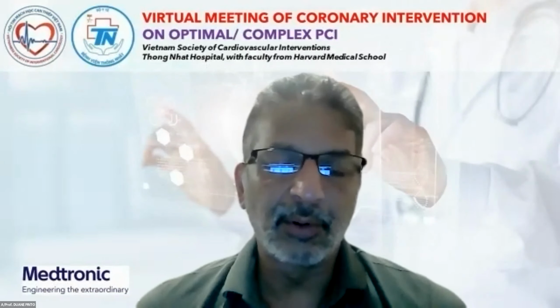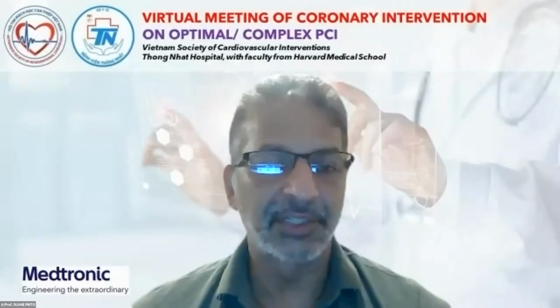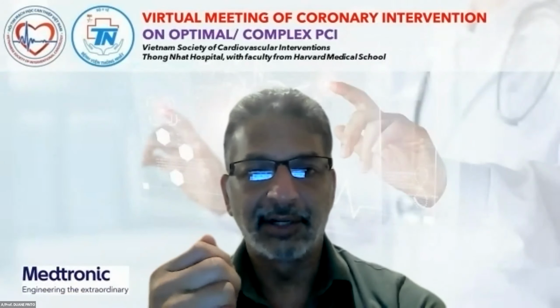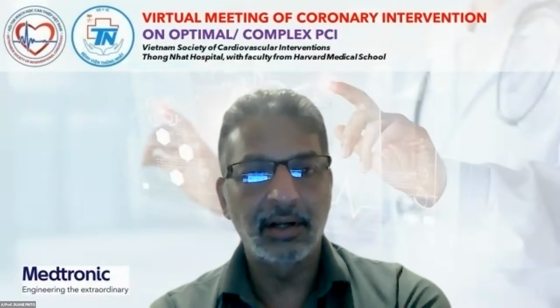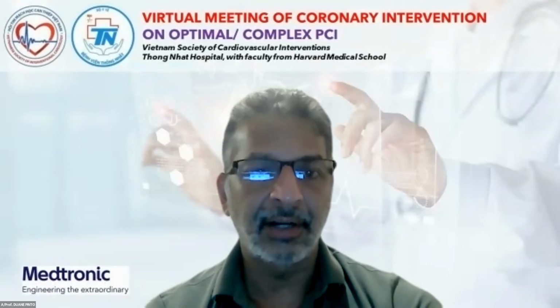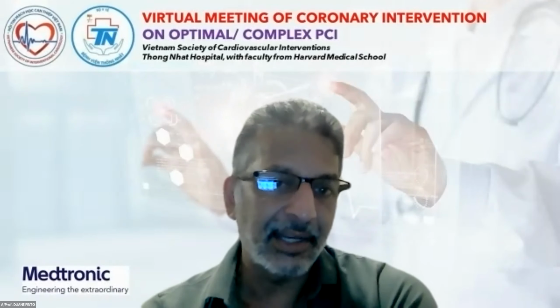I think it remains to be seen whether an underexpanded stent like this without circumferential calcium will work with lithotripsy. There's some accumulating data that nodular calcium can be treated with lithotripsy, but I think we don't know the truth yet. I think at this point, if I were in Vietnam and did not have everything like I have in the United States, I would be using an OPN balloon at very high pressure, scoring balloons, and again, I'm very interested to hear what you would have to say.